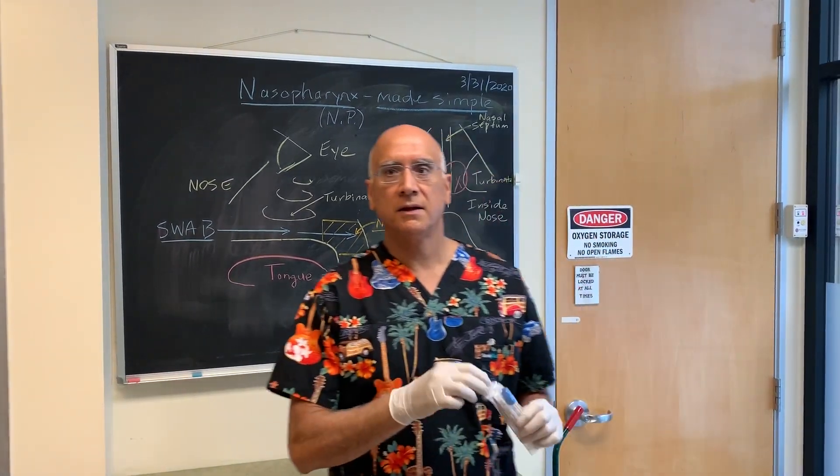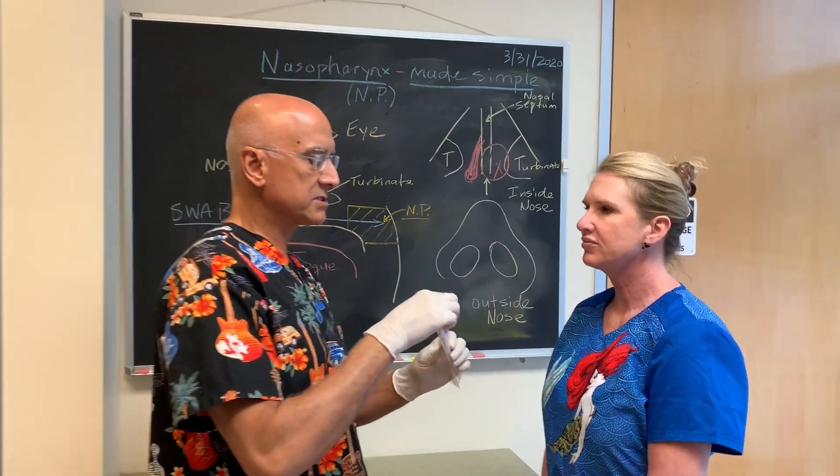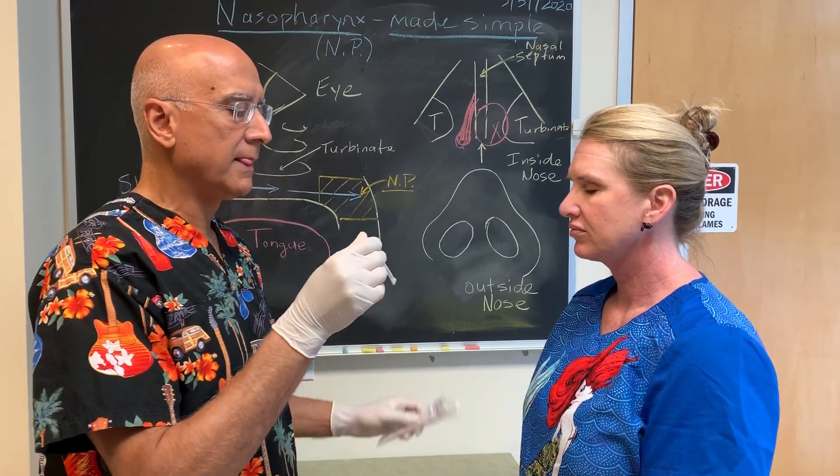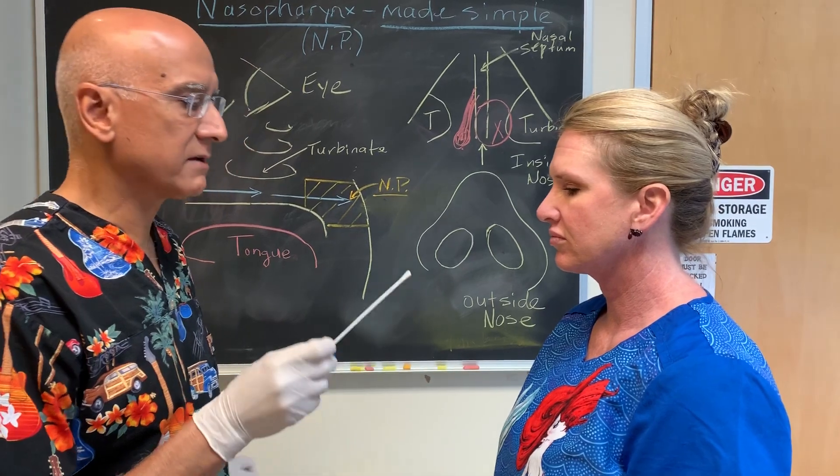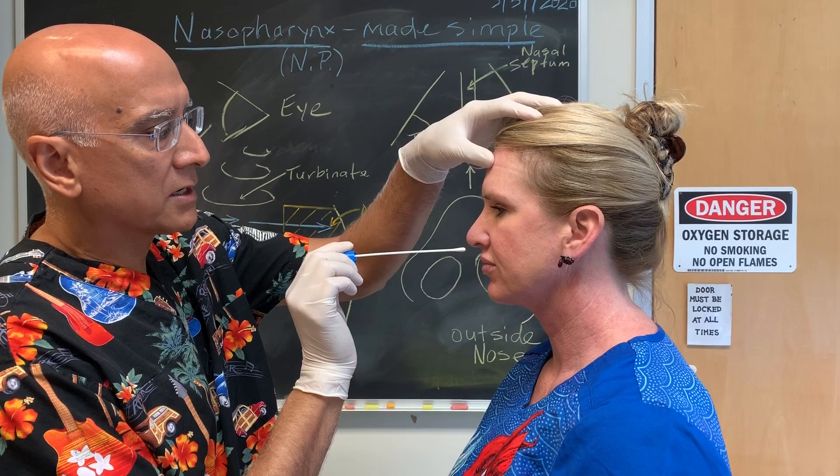So let me show you. Come on in, Gatti. I'm going to show you what we're going to do here. This is obviously all sterile technique, we wear masks and gowns but we're not doing that, it's just to show the anatomy today. There's a double swab but we're just going to take one out just for sake of demonstration. So here's her head has to be straight like that and you want to go into the nose like this but you don't want to go up and you don't want to go out to hit that turbinate and you don't want to go inside.